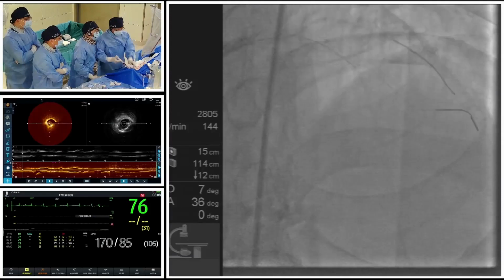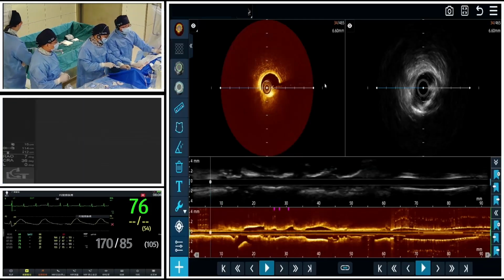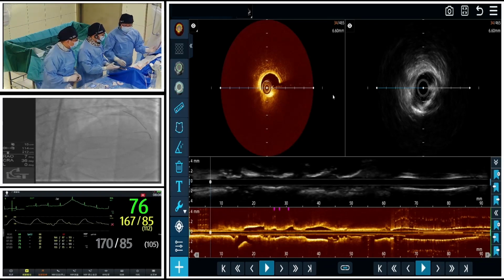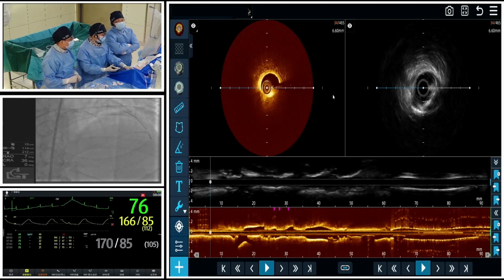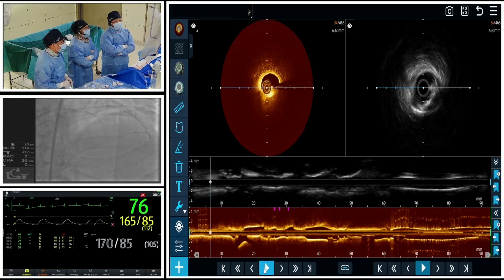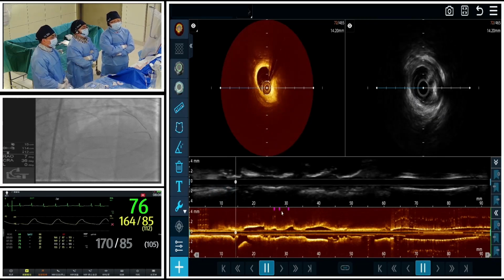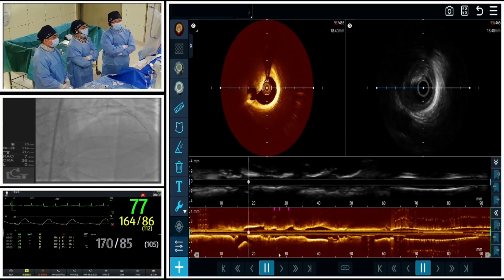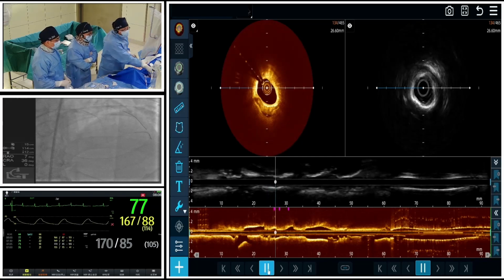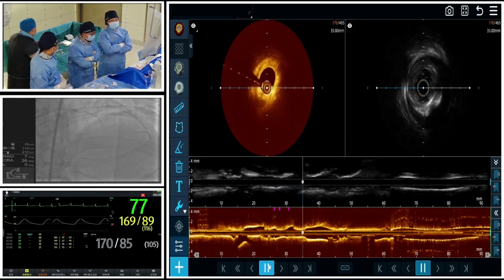Here, I'm demonstrating this hybrid system of IVUS and OCT. Actually, this is a fantastic demonstration, I think, because for some very complex plaque structures like calcified plaque and also vulnerable plaque, sometimes the OCT image and also the IVUS image can be hazy and hard to tell whether it's a calcified plaque or, for example, TCFA or something. But with the help of this hybrid system, we can easily tell the details of these plaques.